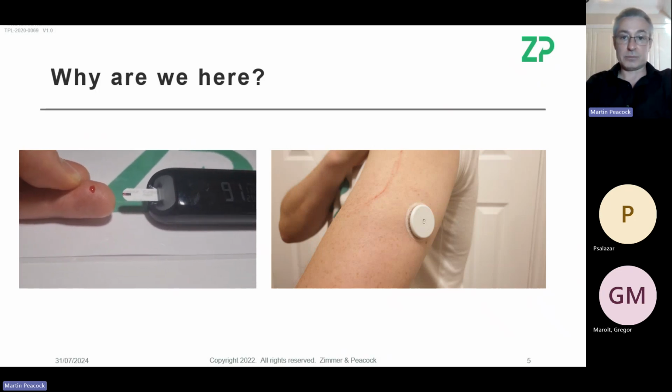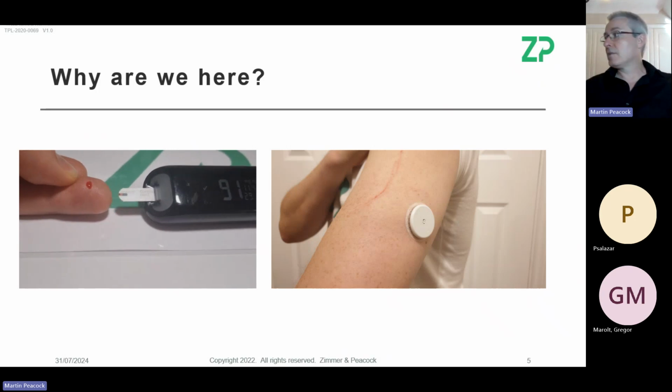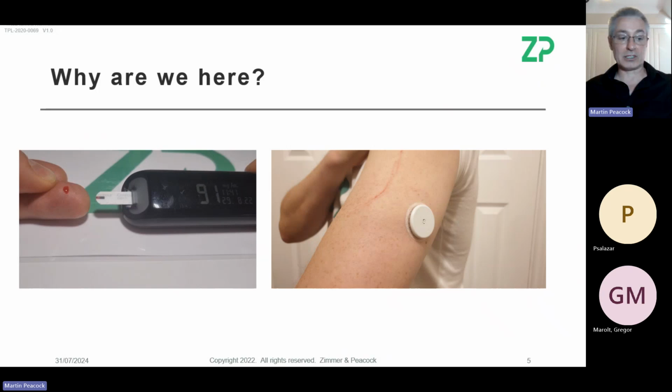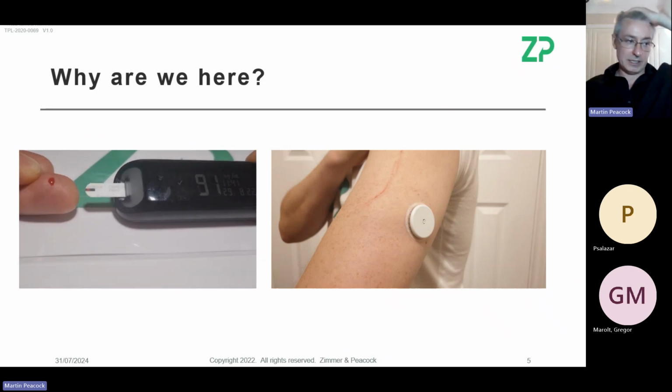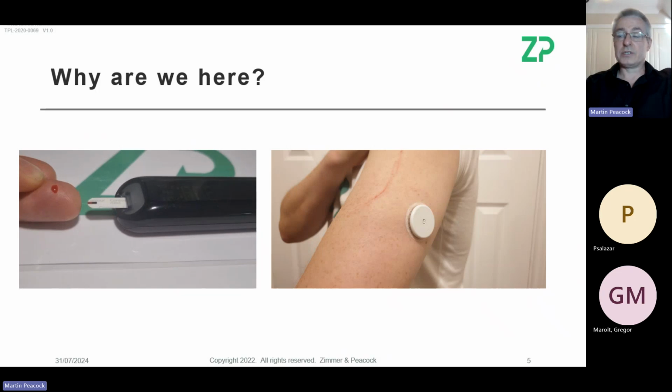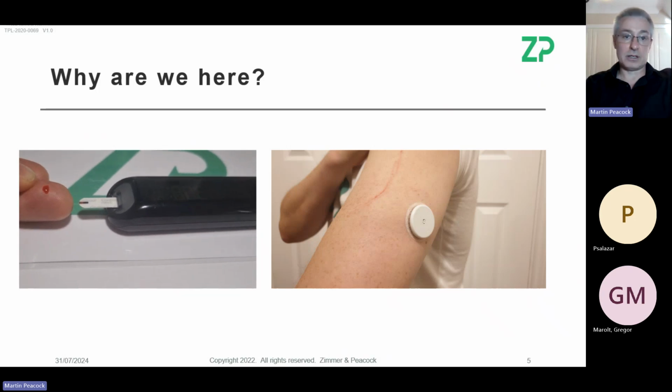They were intending to put a CGM on the market, but they did what's called a pivot, where they have to change plans quite quickly. Around 2000, they realized how hard wearables were. They wanted to get to market, so they went to market with a blood glucose meter.